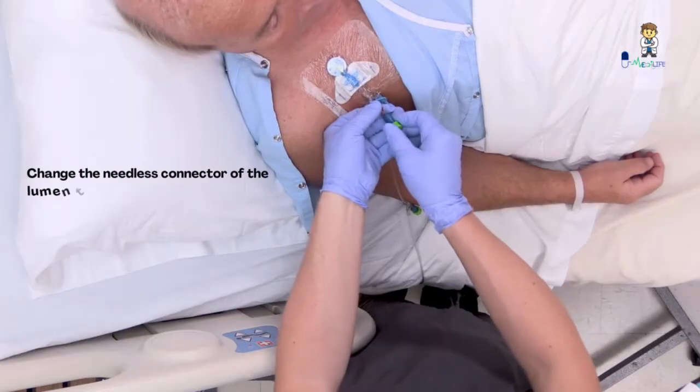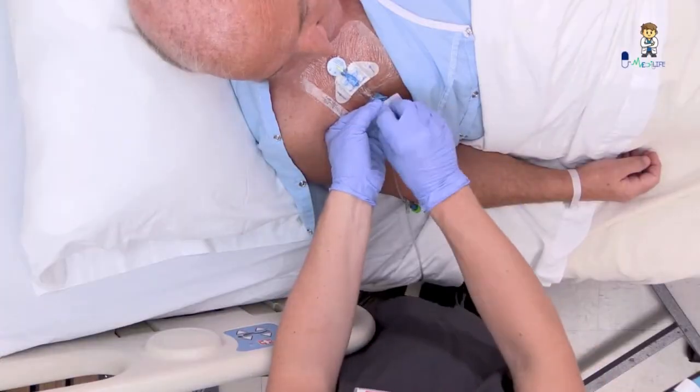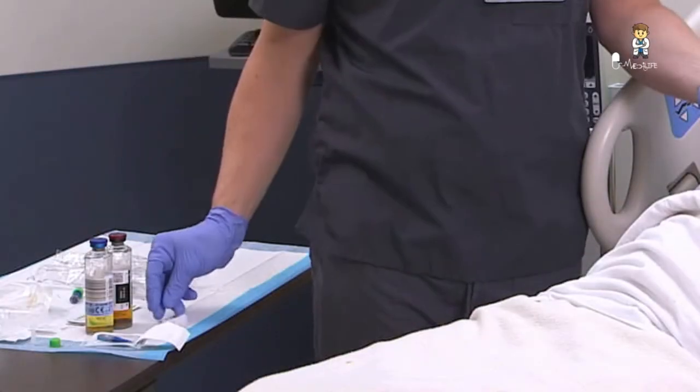Clamp the catheter to prevent accidental exposure to blood and to reduce the risk of air embolism. Change the needleless connector, then perform a vigorous mechanical scrub of the needleless connector for at least five seconds using an antiseptic pad and allow it to dry.